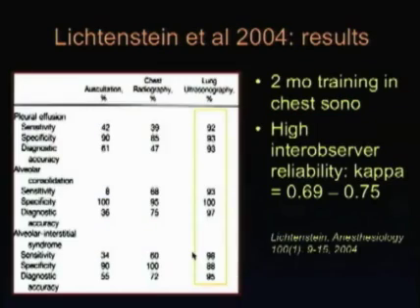That's 384 areas. This is a busy table, but it essentially shows the percent agreement for each of these diagnoses between the various modalities and CT scan. Auscultation, for example, had 42% sensitivity for pleural effusion compared to CT. For alveolar consolidation, it was actually very specific.